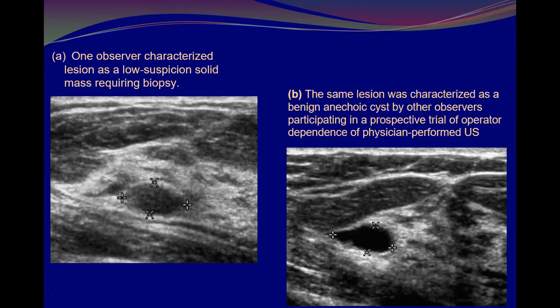So this is more optimized, B1 is more optimized. Regarding what? We have two main points: the focal zone of the image, and the grayscale, the TGC.